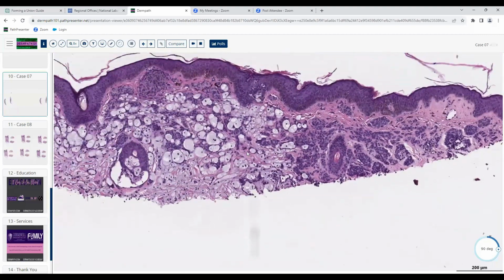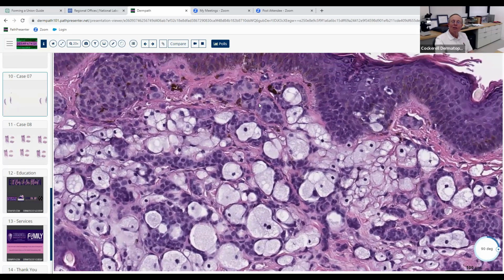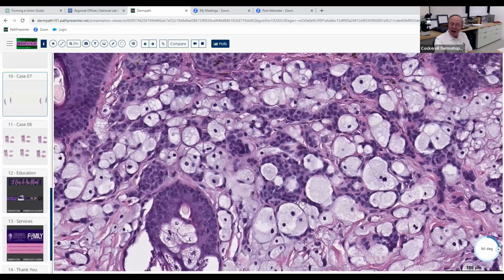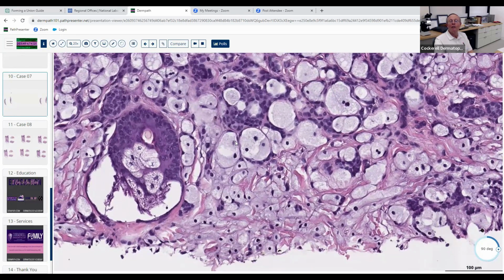Yeah, that's it. What's going on over here? Those look different. It's kind of like a foamy light grayish material inside. How do we add that up with the nevus here? And the cells are contiguous with the nevus. Maybe it's some kind of specialized nevus. Yeah. Like nevus sebaceous. Well, these aren't sebaceous cells, though. They don't have those little nuclei with little strands. Here's sebaceous. Nice example. See that? Sebaceous cell. These cells are not the same. They're different.